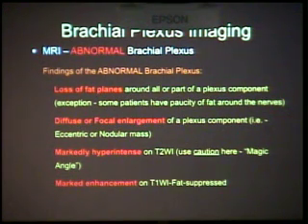If the nerves get enlarged, like focally, it could be something like a nerve sheath tumor or a metastasis. And then use your post-contrast T1 weighted images with fat suppression to look for enhancement.